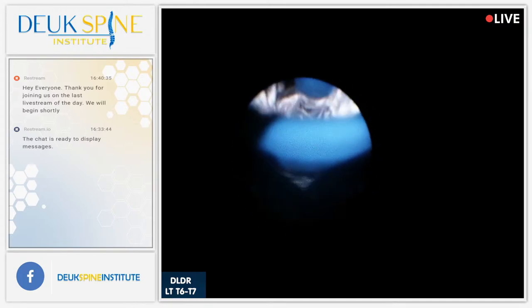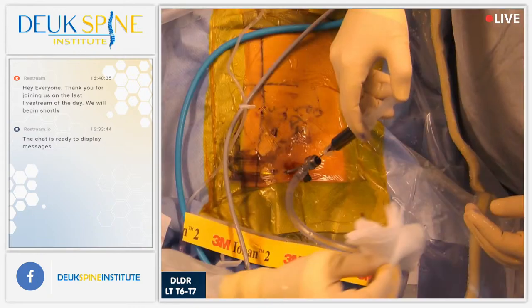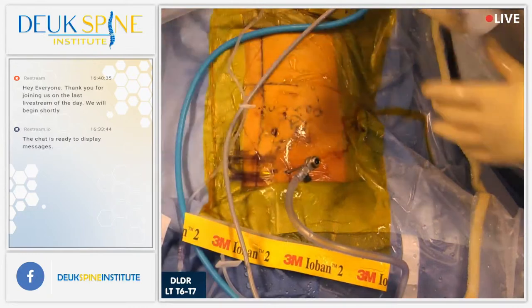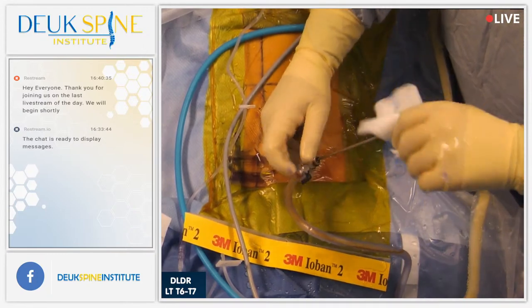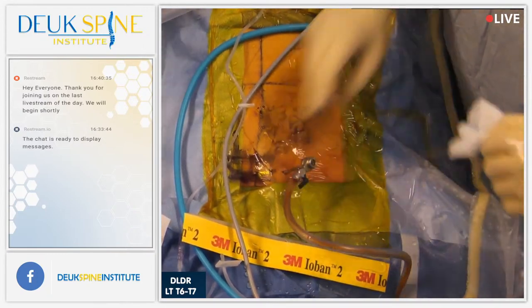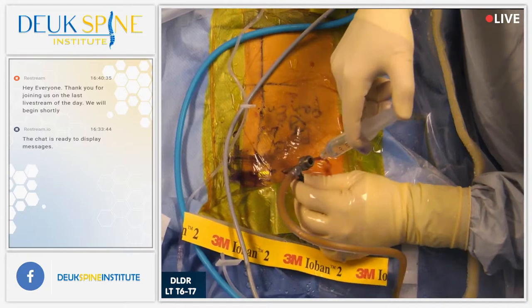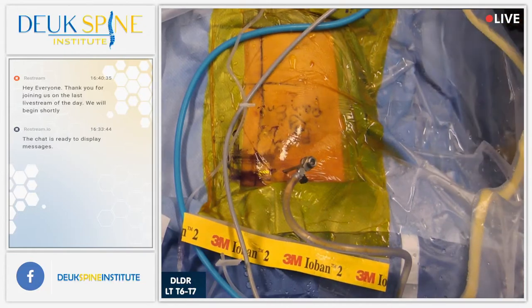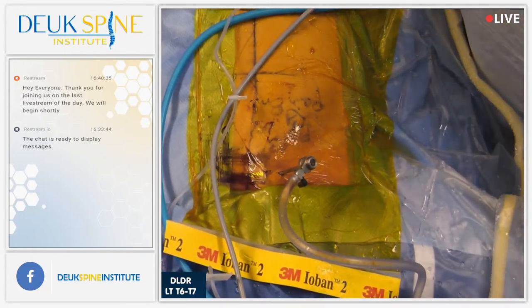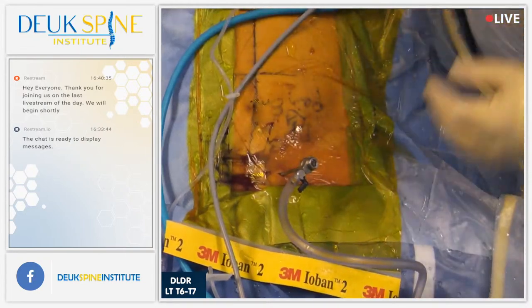Beautiful, done. See, folks, you take someone suffering from a herniation that nobody will touch, no doctor will fix, and the only treatment available before this Deuk laser disc repair was a costotransversectomy, or what's called a lateral extracavitary approach, or a transthoracic, which won't work because the disc herniation is not in the right place for that. Oh, God, that's craziness. 10% of the people die from that surgery. But this surgery is simple, straightforward, outpatient. She'll be going home in an hour. It's wonderful.